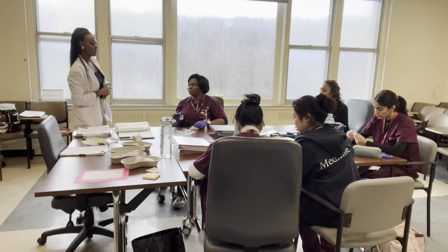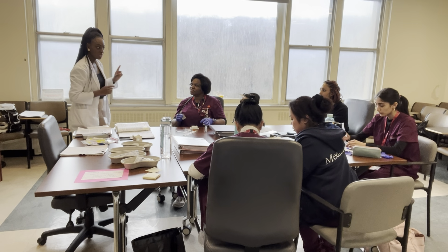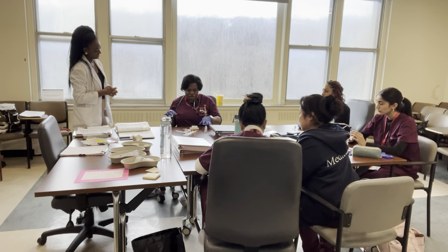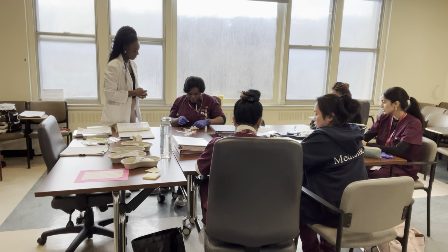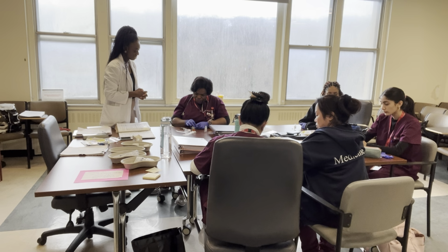Okay, so can somebody help your sister out? She said it's going to be 2 units from her belly button. It's 2 fingers, listen to her. Oh, 2 inches, sorry, 2 inches. Then I wait, good, 10 seconds.